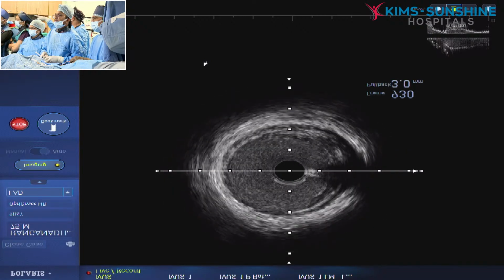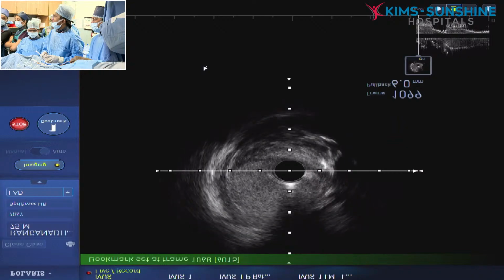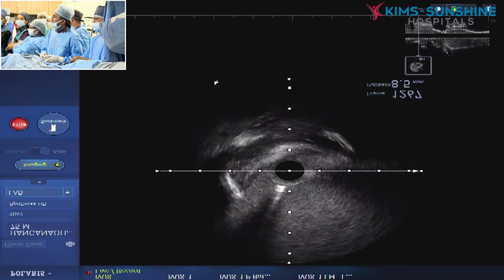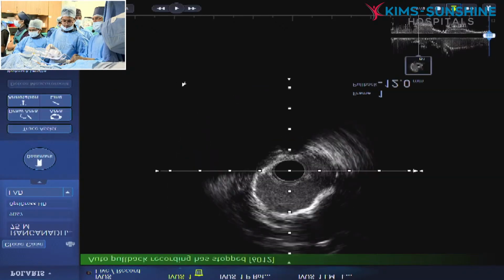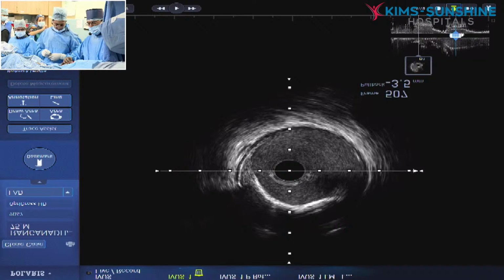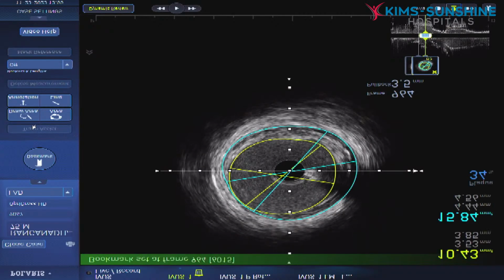that is all LM. Distal LM is a very tight lesion, severely calcific. This is the plaque burden of the LCX. Even at the ostial site also some plaque burden is there. Now, can you check the LCX areas? LAD ostium and LCX area. Close it. Almost 3.5.